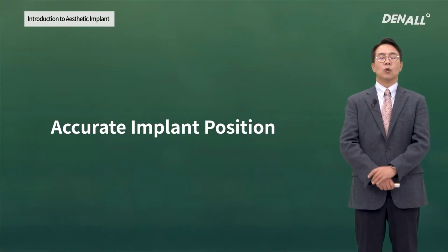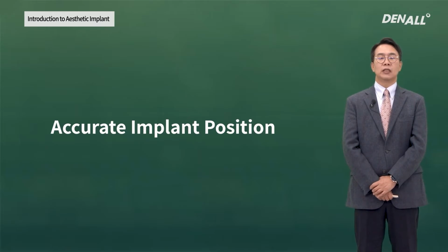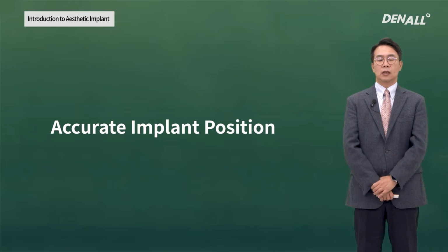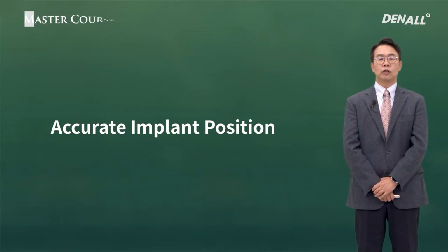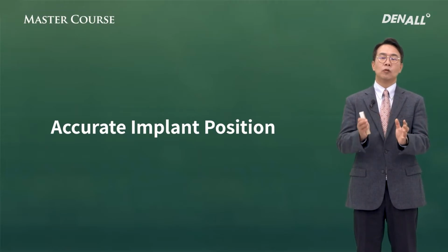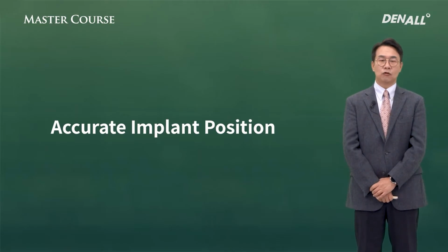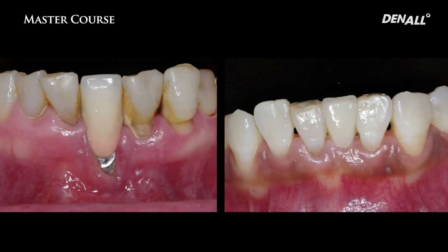So based on that, how can we accurately position implants? During surgery, the evaluation results would be reflected, and the surgery should be used to place implants accurately for the optimal prosthesis. Number 31 implant is exposed. On the left, number 31 is an implant as well.